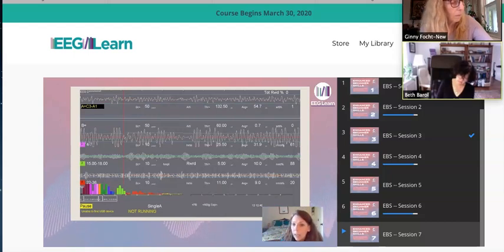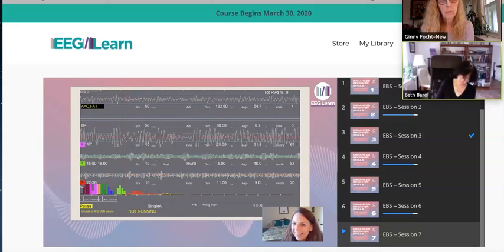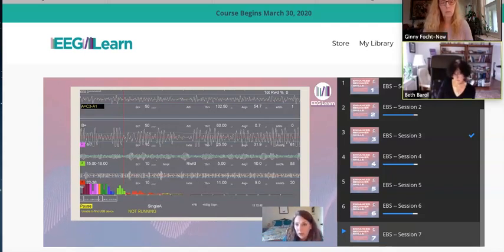And when I have people train with the therapist screen, I just highlight the frequency band that I'm really interested in them working on. I'll point out the average amplitude, and I'll say, see if you can make that number go down. If it comes down any at all, that's great. If it goes up, I want to know what you're thinking about, right? And if you see that going up and you notice you're caught up in a thought or a daydream or getting sleepy or something like that, I want you to see if you can shift your focus outward.